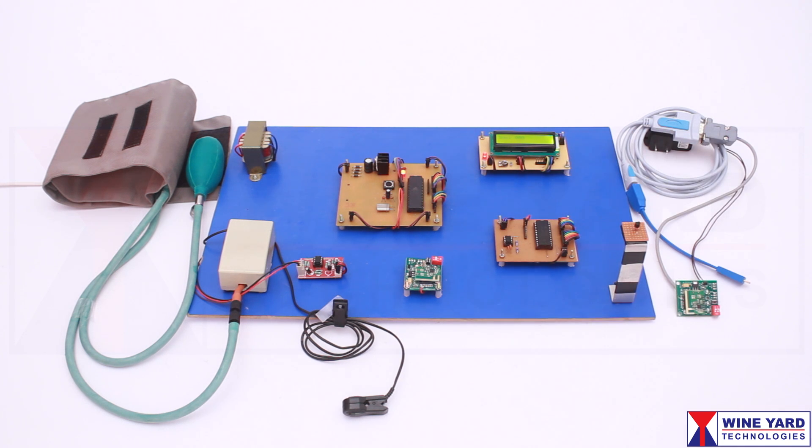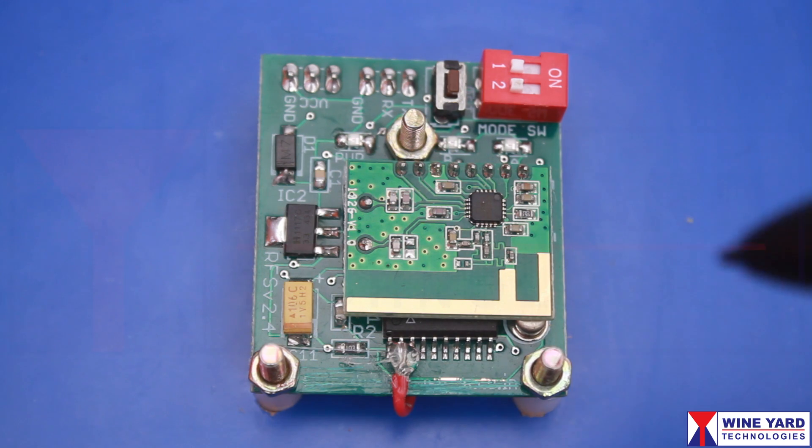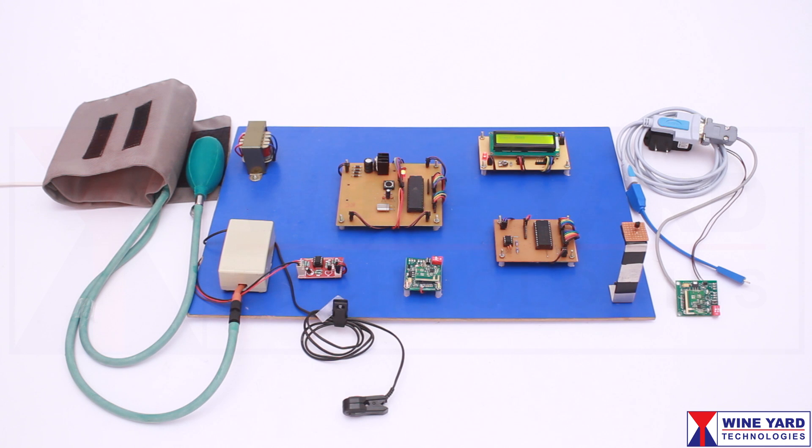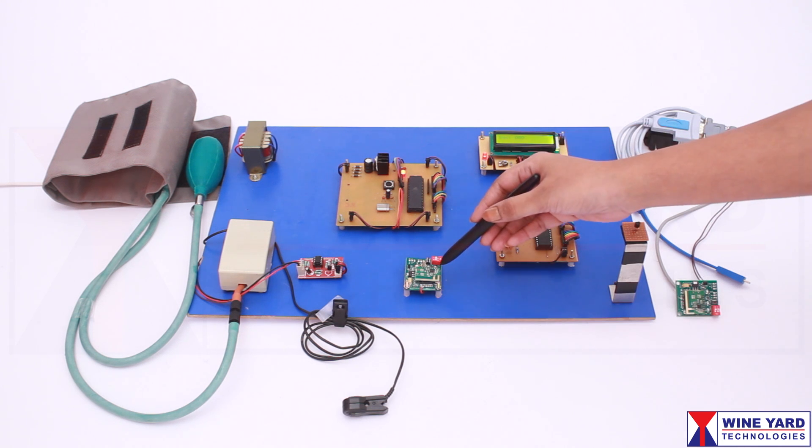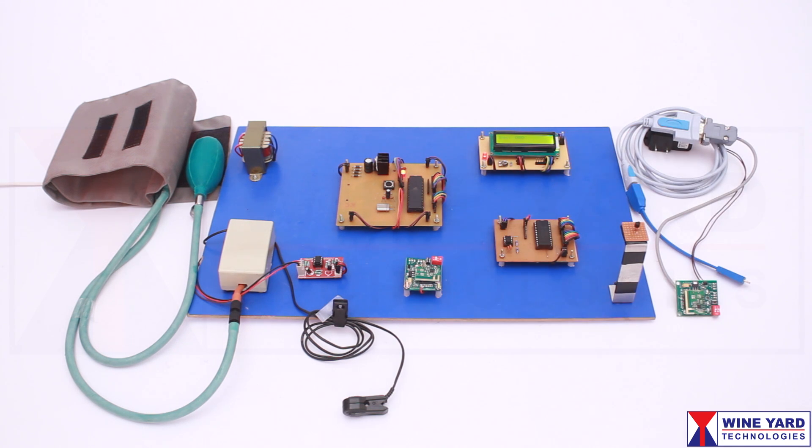We are using a CC2500 Zigbee 2.4 GHz RF transceiver module for wireless communication. This CC2500 Zigbee RF module is configured as a transmitter.